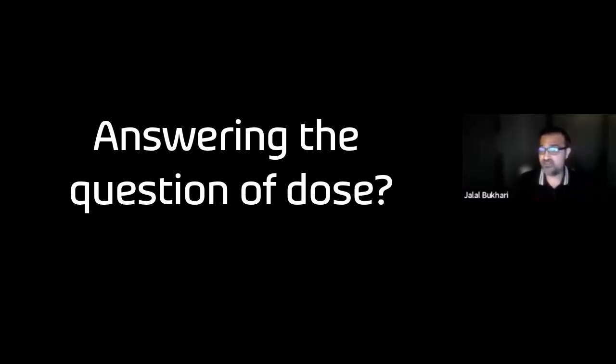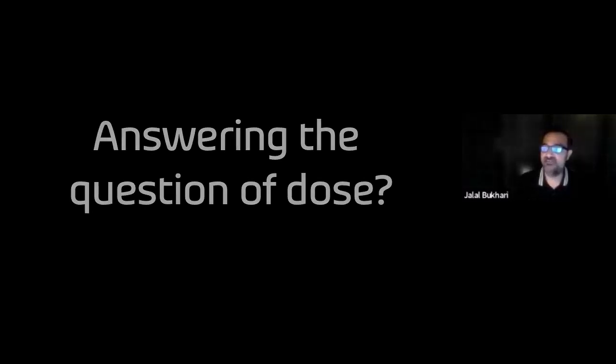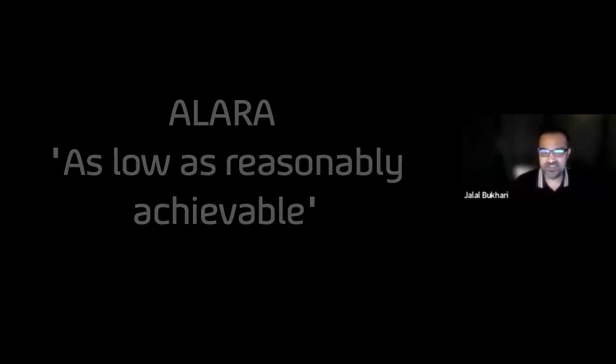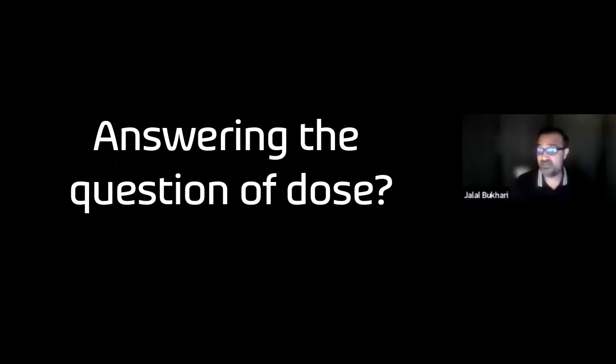So even though the radiation that a patient is exposed to in dental radiography is low, once a decision has been made to obtain radiographs, it's our responsibility to follow what's called ALARA, as low as reasonably achievable. This is to minimize the radiation exposure to the patient. One way of doing this is to take the field of view that's absolutely necessary. The dose is also dependent on other factors, some of which can be controlled by the CBCT machine and the operator. Some machines actually provide low dose settings to minimize the total dose that a patient can be exposed to.